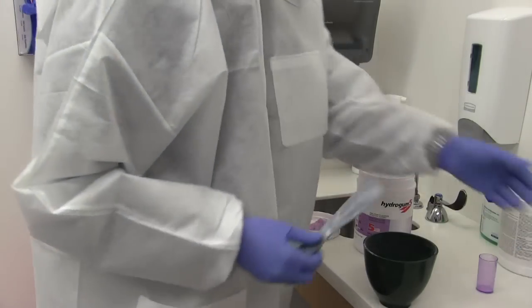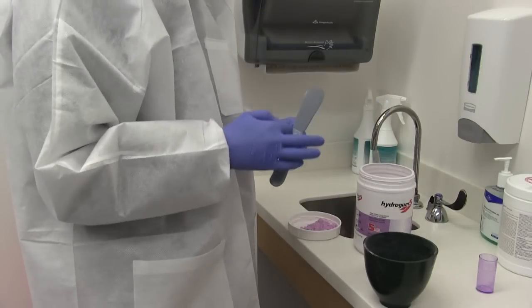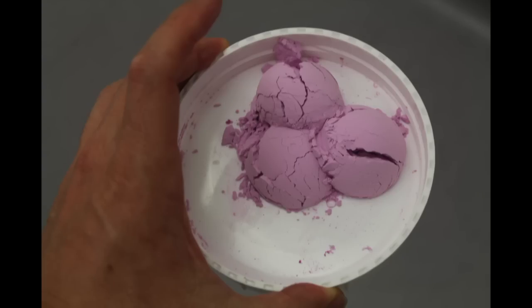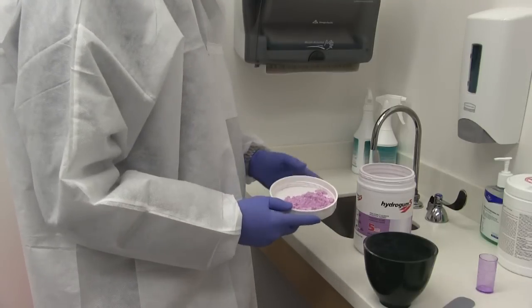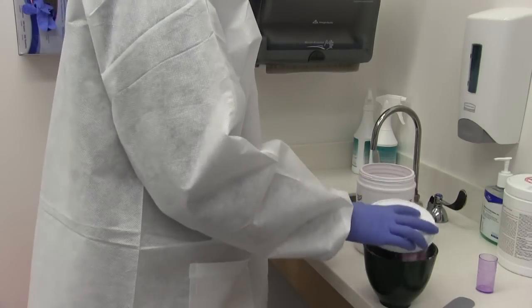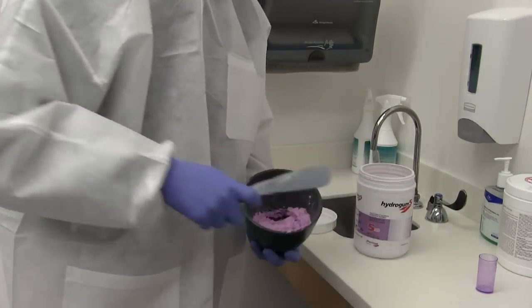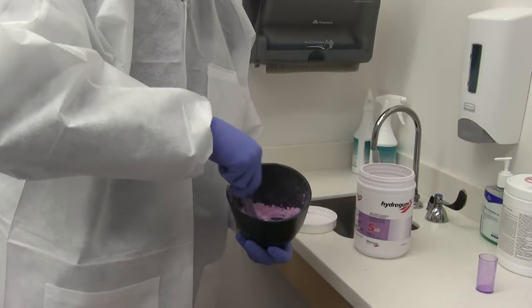You can see it's sterilized. In the bowl behind us, I have three scoops of powder set aside previously, so I can put the water in first and then drop that powder in and begin to manipulate. I'm going to use alginate here, not alginate substitute.